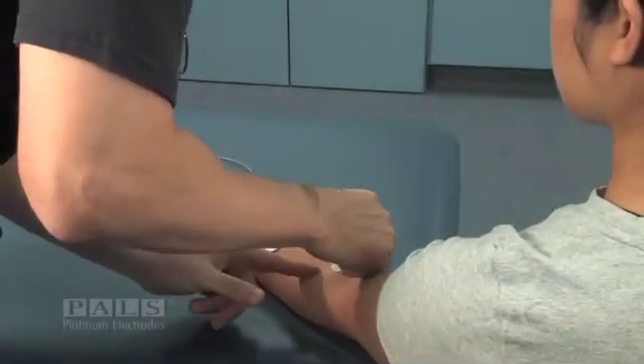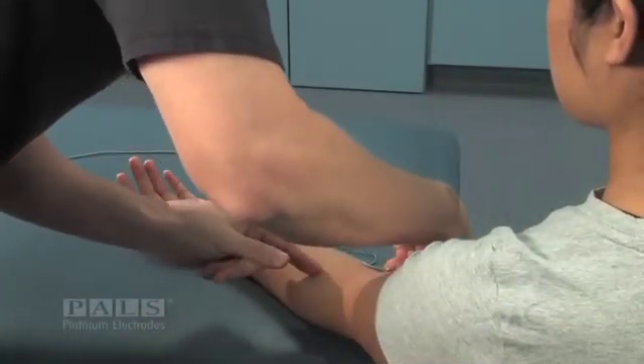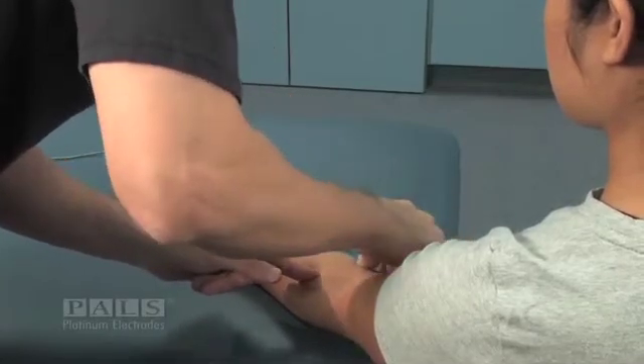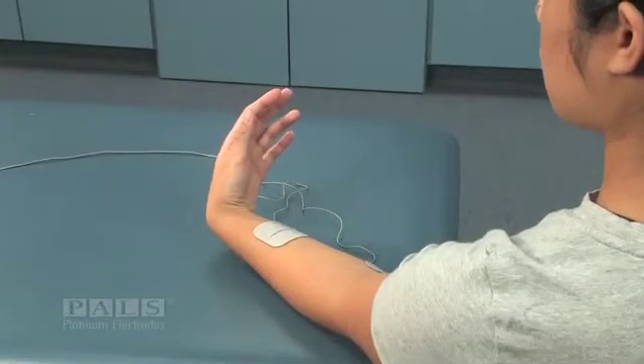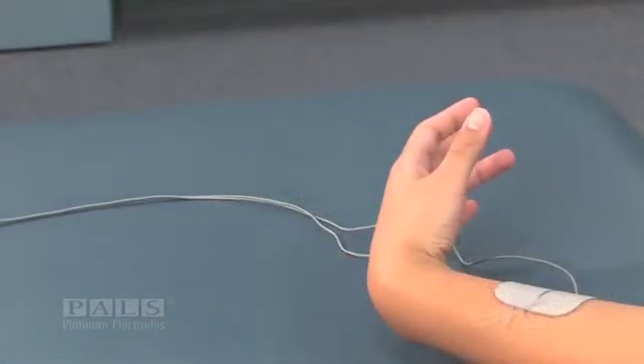When the negative electrode is moved ulnarly by about one centimeter, you can see ulnar deviation and some pronation.